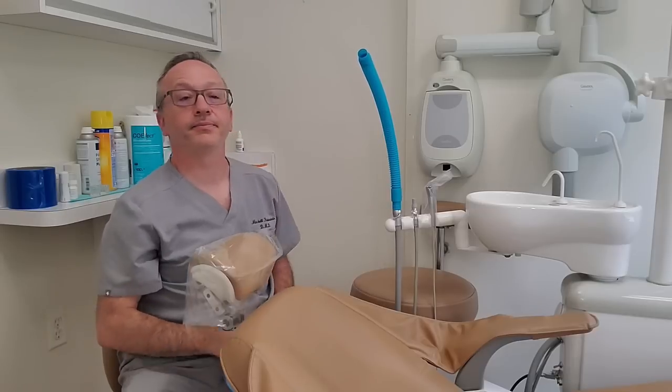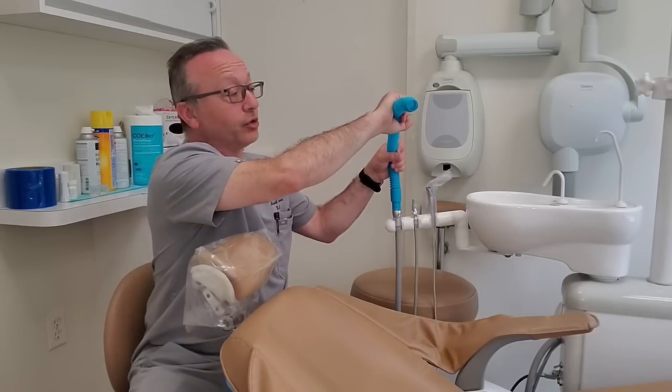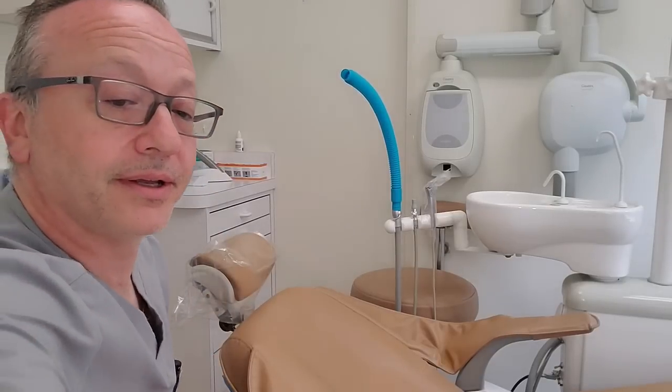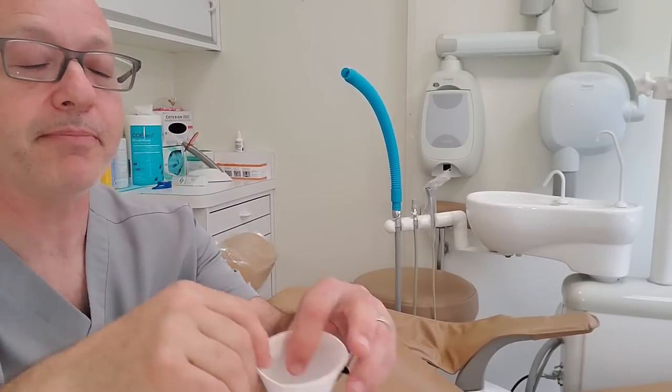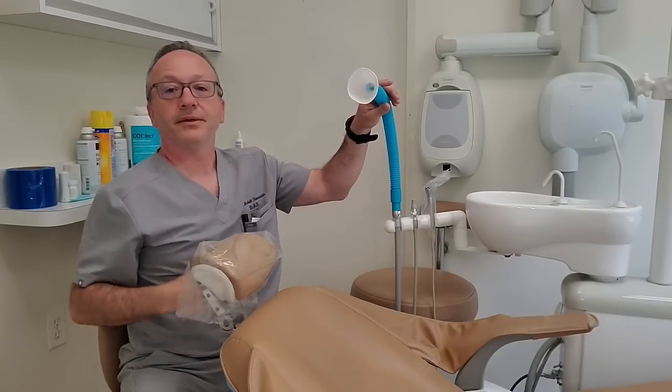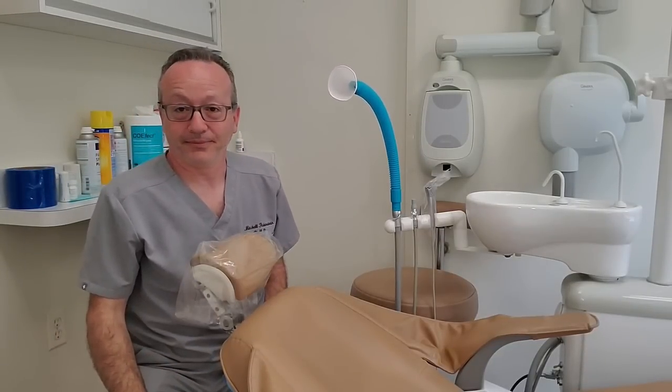You turn your suction on. Now, you bend the tube around a little bit. Then you take your funnel — your paper cone — which has a little hole in it, just a little bit smaller than the tube. It goes right in there.